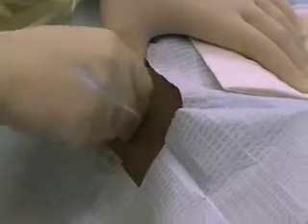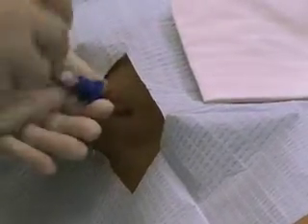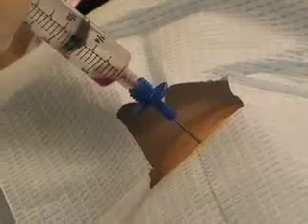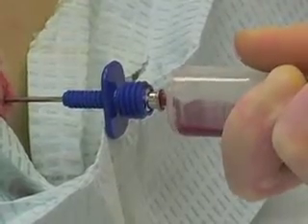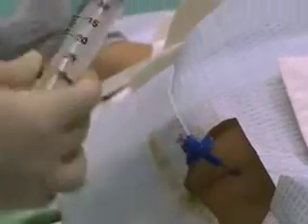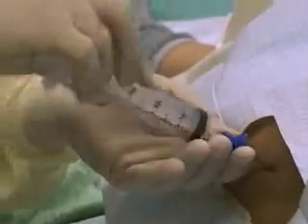Once the needle is through cortex and the marrow cavity is entered, the needle should stay in place without being held. Next, remove the stylet. Attach a 30 milliliter syringe without heparin and aspirate 1 milliliter of marrow with a firm pull. Since the aspiration itself can be particularly painful, it is prudent to warn the conscious patient before you aspirate. Note that you may hand a syringe to an assistant or pathologist, taking care to maintain sterility.